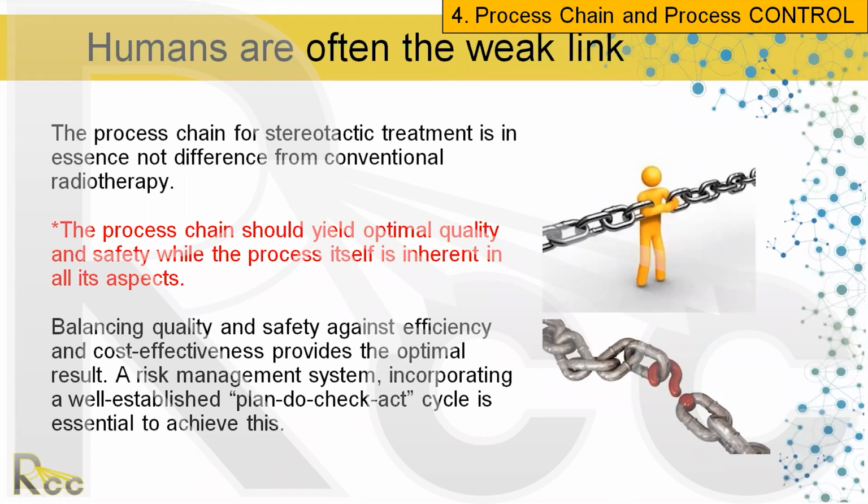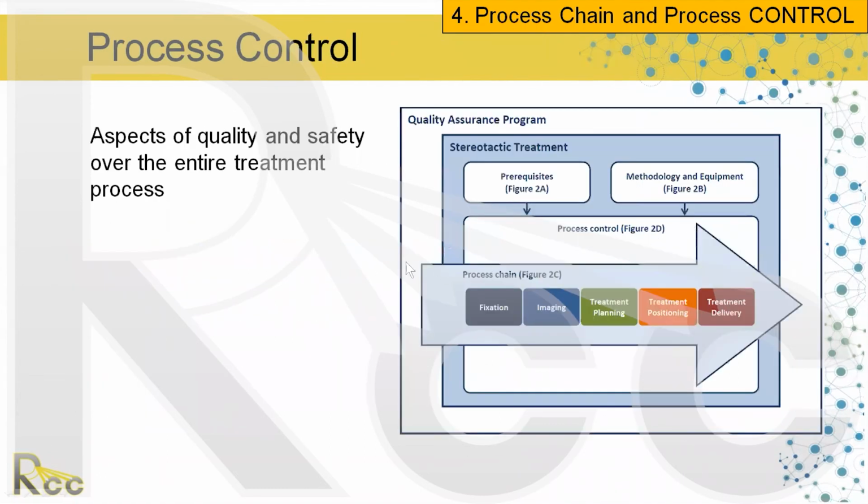Machines do things that are often reproducible. Sometimes we haven't had our coffee that morning, or we haven't been able to stop since 6 a.m., or whatever it is. So humans are often the weak link. So creating a process that can protect from human error is really important. But again, knowing your process and your system and protecting from those possible error points is important.